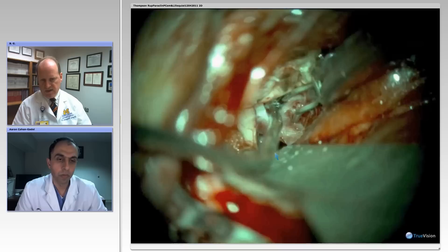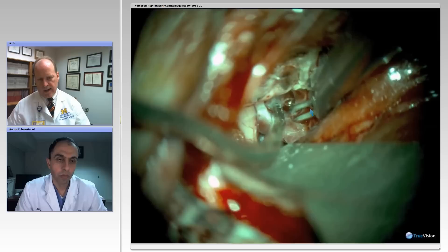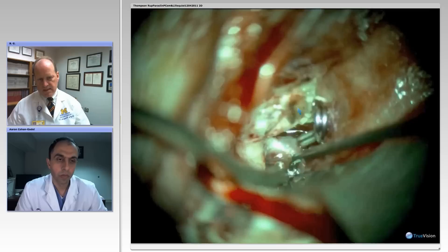The first thing that I try to do always is to see the internal carotid proximal to the aneurysm — have a place that I can get a temporary clip on if I should need it. And here, actually, the clinoid's been drilled away. On lateral-pointing PComA aneurysms, as opposed to posterior-pointing, I like to use a bayoneted clip because I can look through the blades of the clip as I'm putting it on the neck.